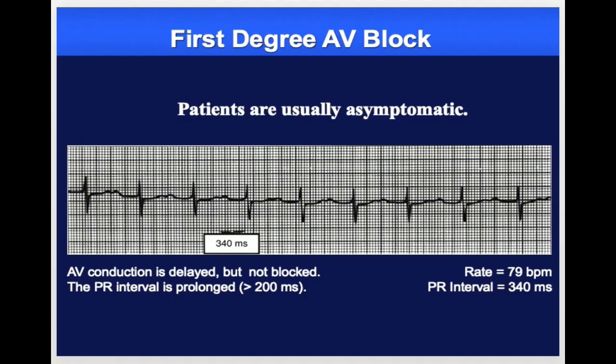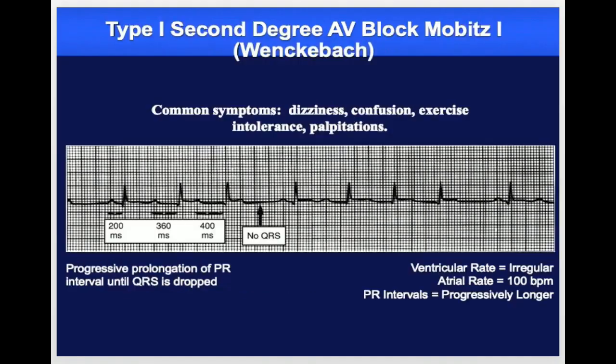You can see in these tracings, the interval between P and R is constant, which is more than 200 milliseconds.